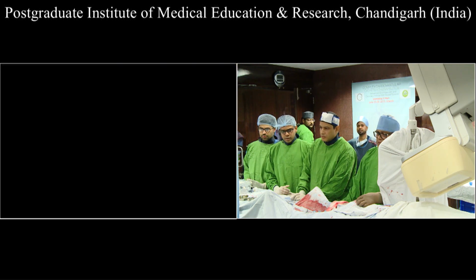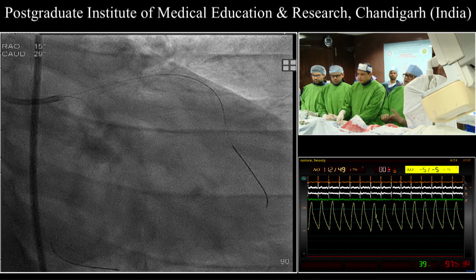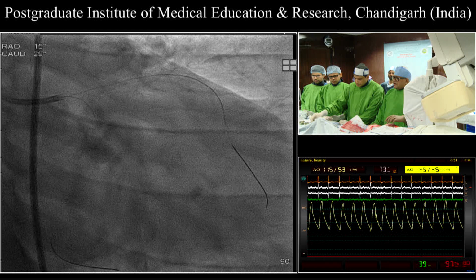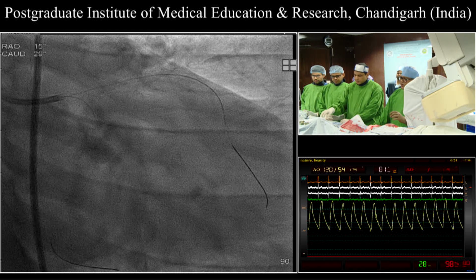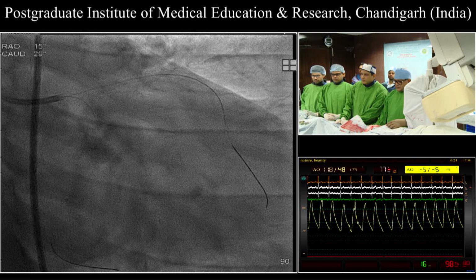So let's go ahead with the procedure. This is basically a case who had a drug-eluting stent across the proximal LAD, and at 9 months of follow-up has a significant in-stent restenosis.